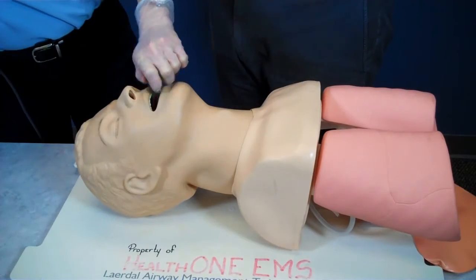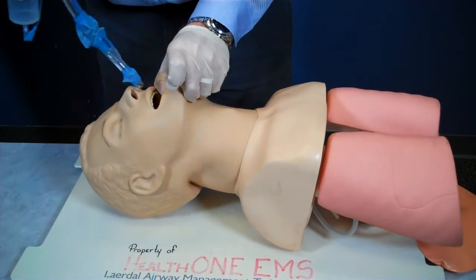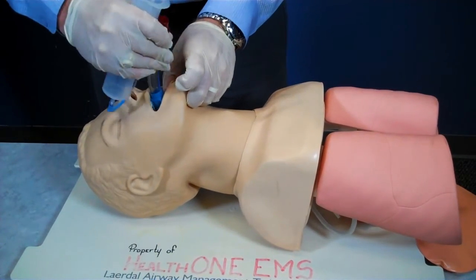When I am ready to insert the airway and I am confident the patient has been well oxygenated, I instruct my assistant to remove the airway adjunct and move to the side. I properly position the head and perform a tongue jaw lift.